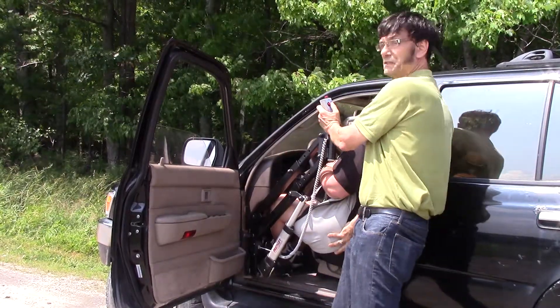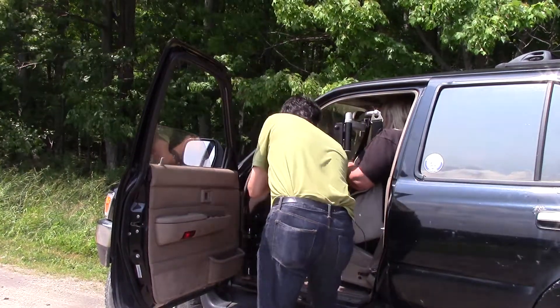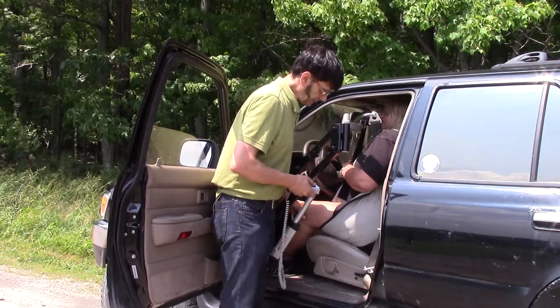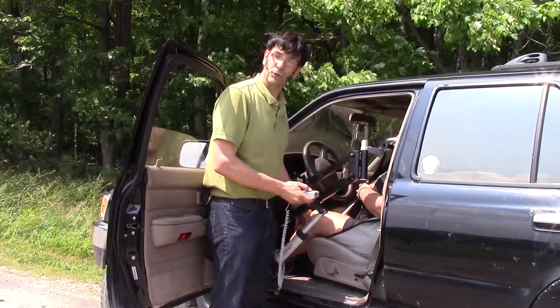Once the head is cleared, as you can see here, we begin to lift and into the vehicle. Get the legs in place, and now just a little bit of backward pressure so that we get the person nice and upright in the seat as we lower — and we're good to go.